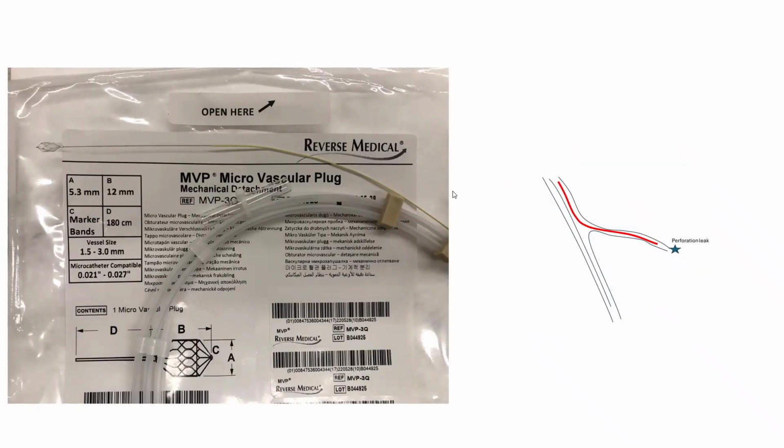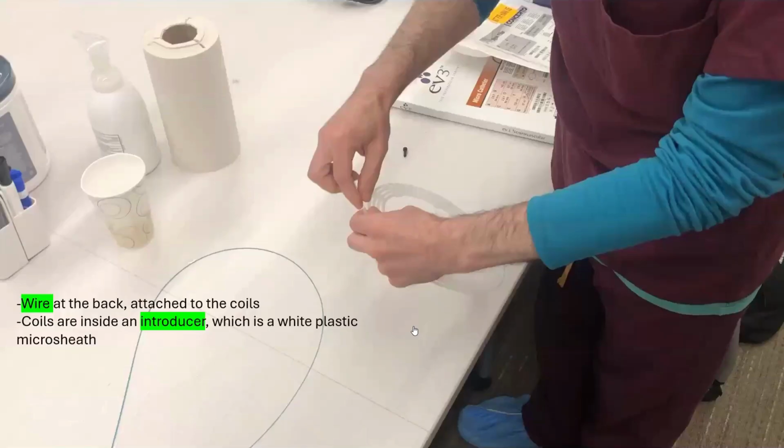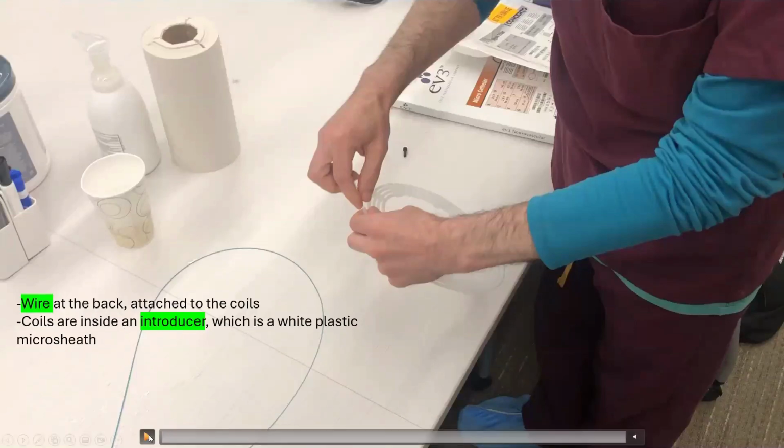And those detachable coils have two components, like microvascular plugs. You have a wire attached to the coils, and you have a plastic introducer sheath. This introducer sheath allows you to push the coil through the microcatheter that is inside the coronaries, and I will show more of that. So this is how those coils come out.